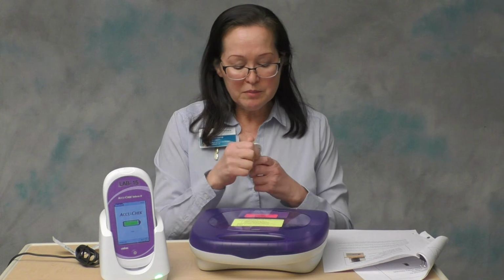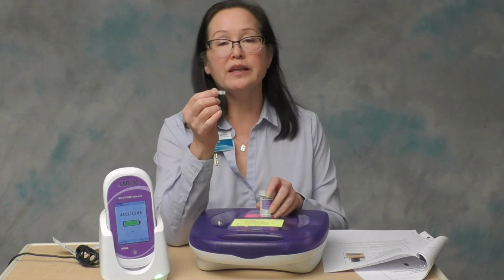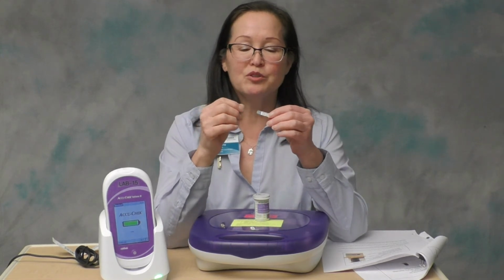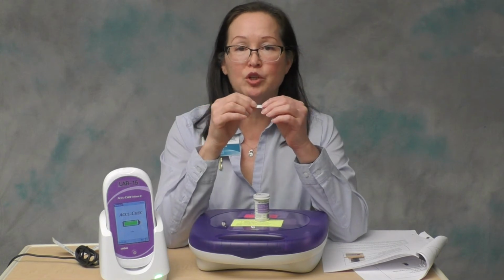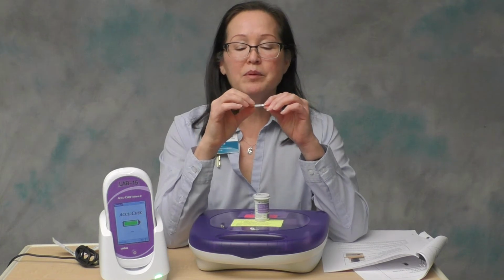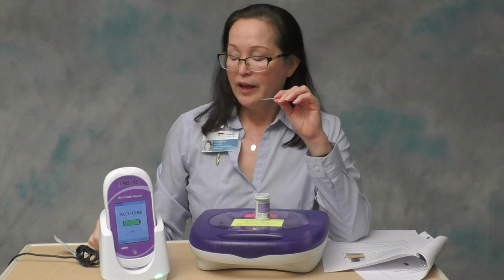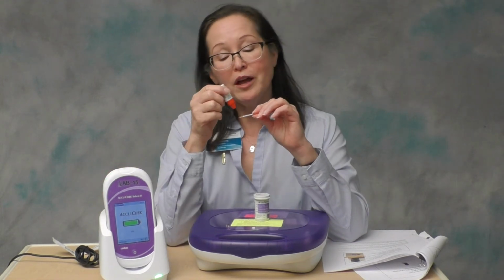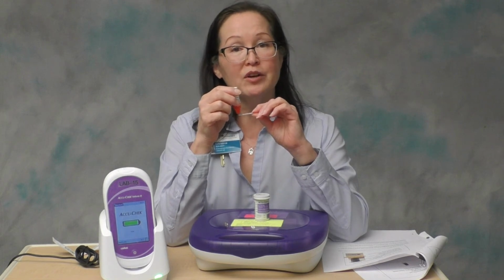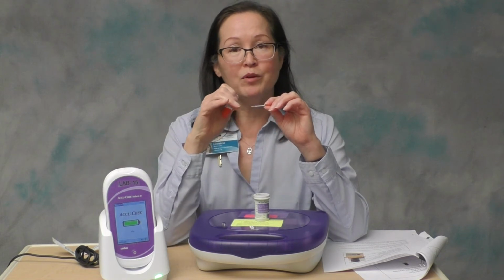And the strips themselves, I'll show you what they look like. They look like this. They're completely laminated, so you can handle them with your gloved hands. You'll have gloved hands, of course, when you're doing this. It's not going to hurt the strip because they're laminated all the way to the end with plastic. But keep in mind, because they are laminated, you could put a drop of QC solution or a drop of blood the size of a pea on the top of this strip, and it will never get to the testing area, and it will likely contaminate the test strip port because it's laminated with plastic.